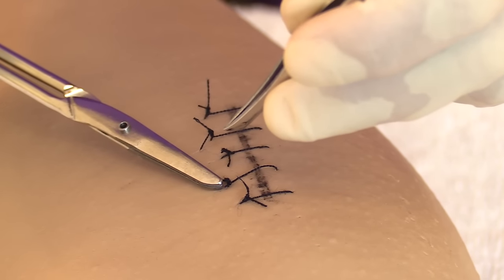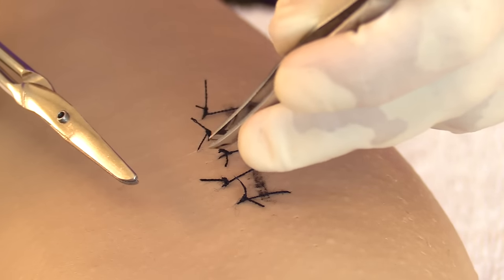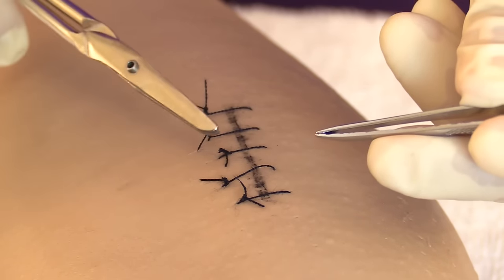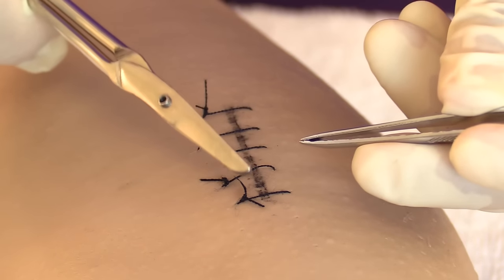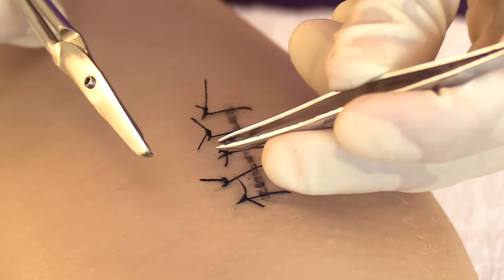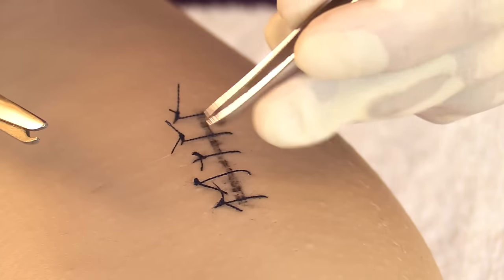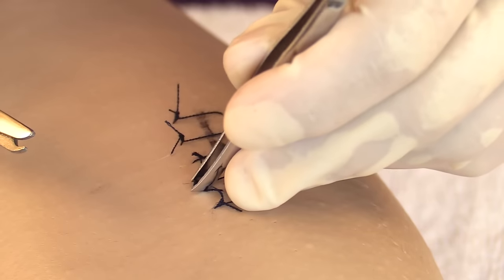With simple interrupted sutures, always cut on the side of the knot closest to the skin. Also, when removing the thread, don't pull the knot away from the wound — that creates tension on the incision line and could cause it to open. Instead, lift up gently and then pull the thread over the wound. Starting at the second suture, grasp the knot with your tweezers.